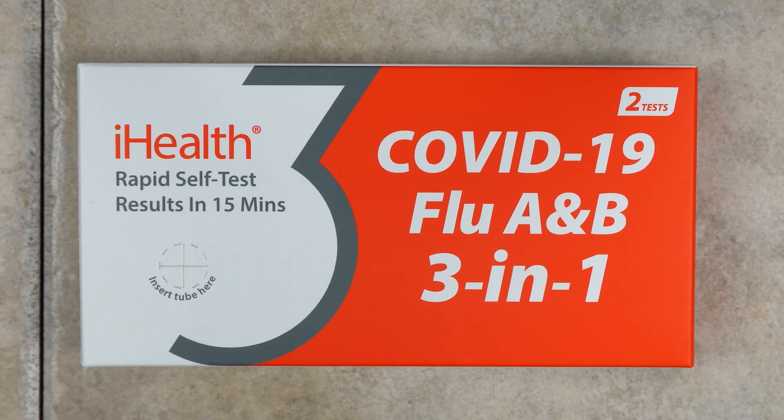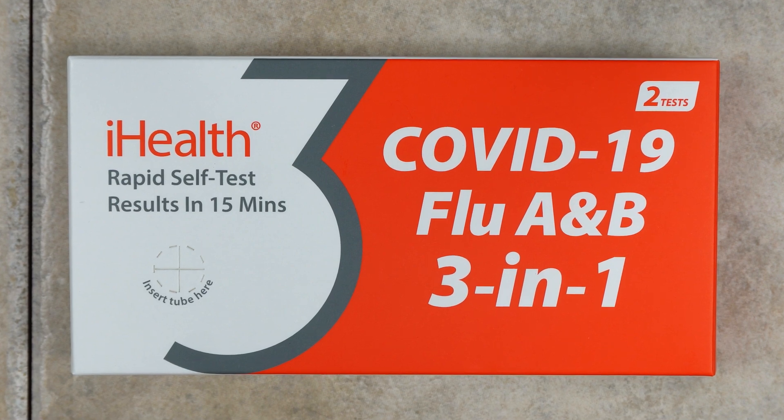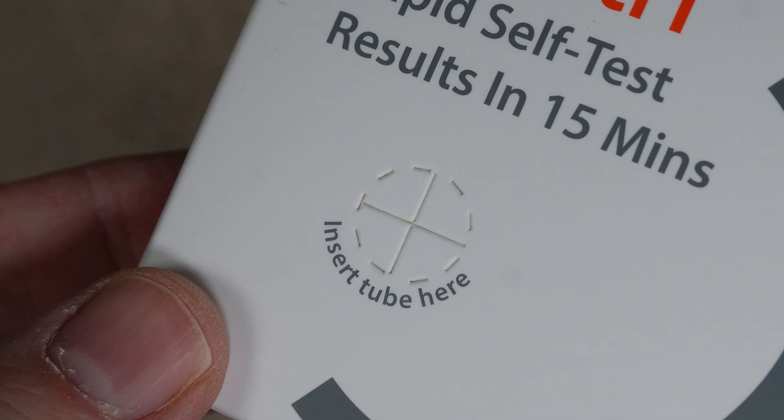I'm about to show you how to administer this COVID-19 and flu test from iHealth. As you empty the contents of the box, be careful not to damage the box too much because you will be using this perforated circle to hold the test tube in a little bit.